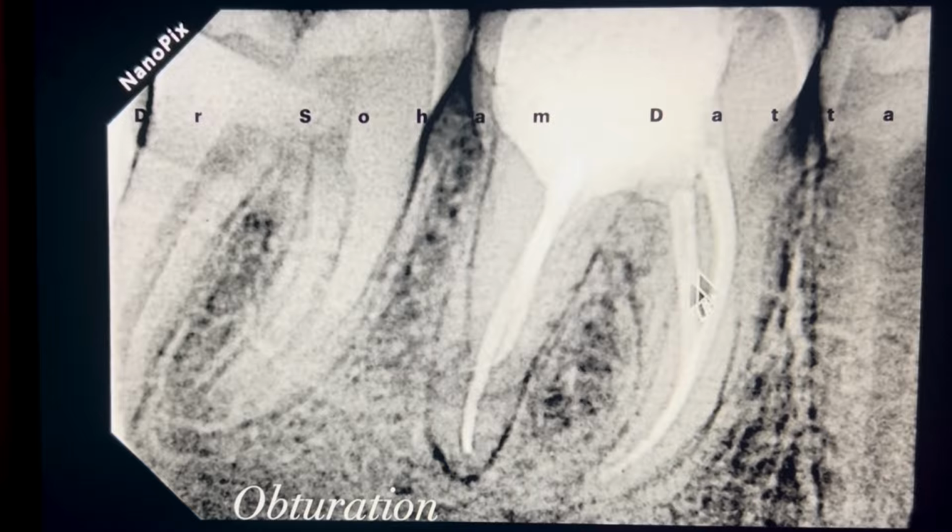Here also 36 GP, but the distolingual root I prepared till 34 because this is narrow, so I don't prepare much. So this is 34, and the rest, distobuccal, mesiobuccal, and mesiolingual, I prepared till 36 because these are wide canals.